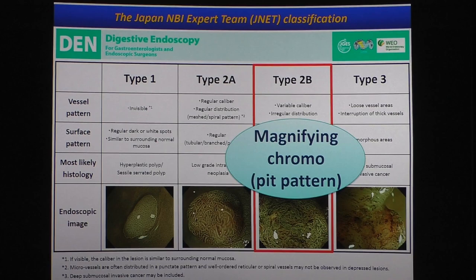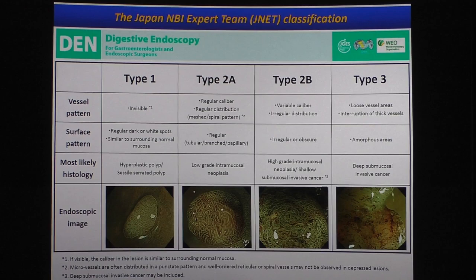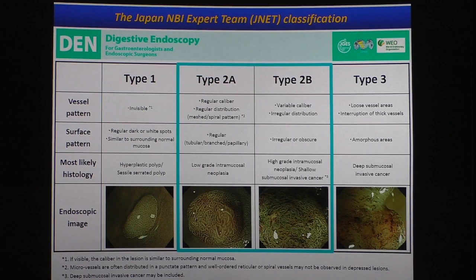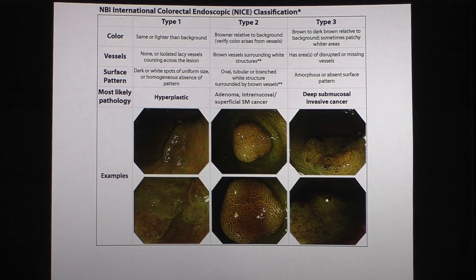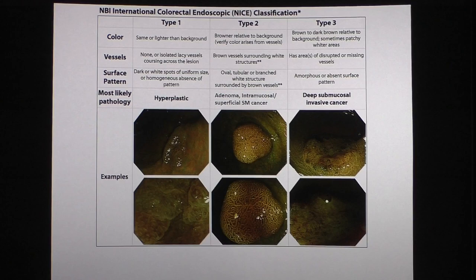If you don't have a colonoscope with magnification, I want to emphasize that JNET classification is based on magnified NBI endoscopy. Without magnification, you cannot use the JNET classification, because the discrimination between type 2A and type 2B is really difficult. In that case, you have to use NICE classification. NICE classification is a very good classification, and it corresponds well with the JNET classification.